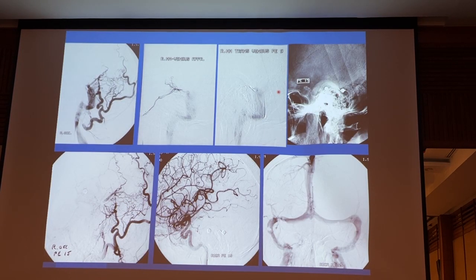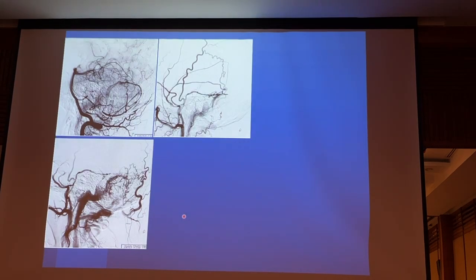So we got into the vein, we catheterized this pocket, we just put in a few coils. This is after treatment. Okay? Certain dural shunts are at one spot. Just like shown in this case, you have to analyze the angiogram very carefully to have effective treatment.